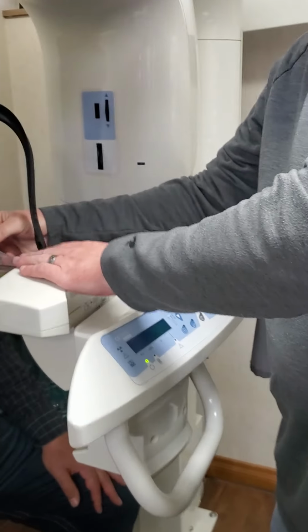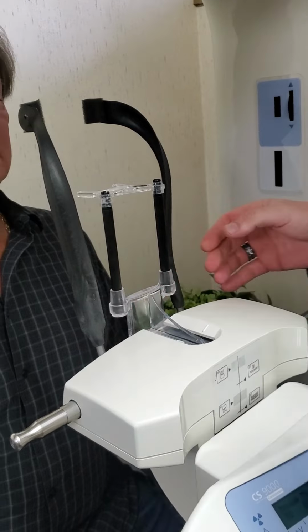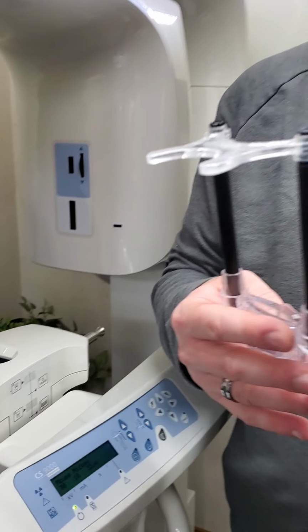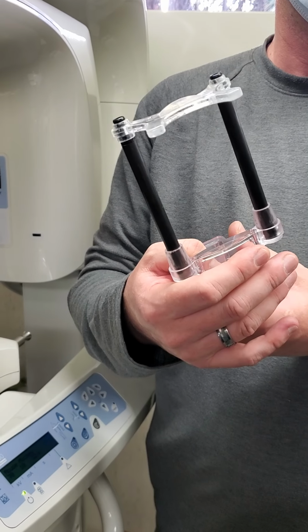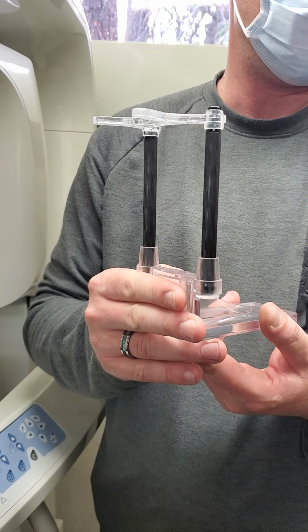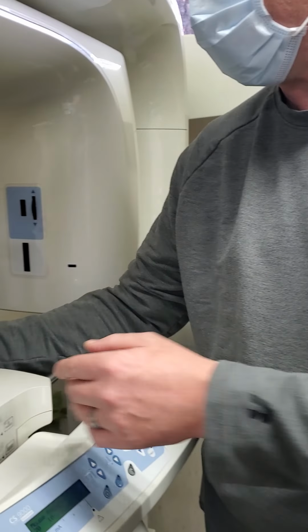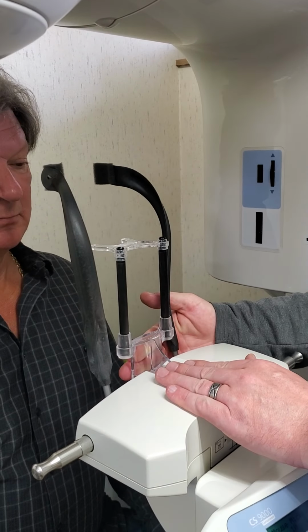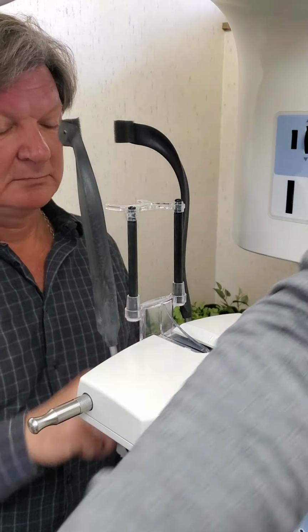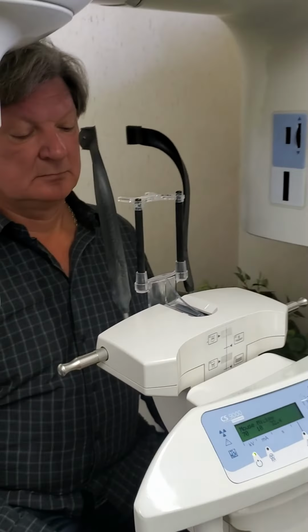It's clear. So you can see there's a difference with the CBCT holder, just in how they bite and how it positions the patient. So you pop it in all the way until it clicks in. Make sure you have your barrier.